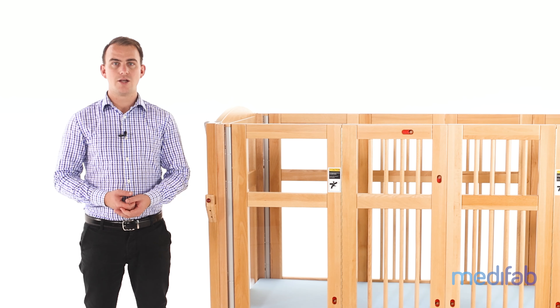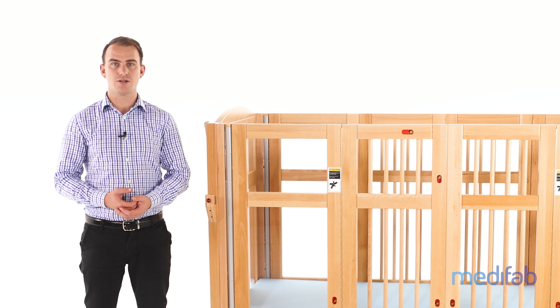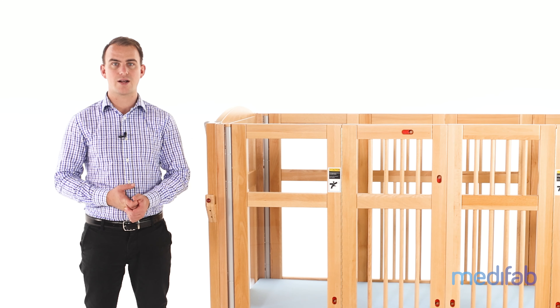In the event of a power cut, you will still be able to lower the bed to a safe sleeping height if it was left in the upper position. If you happen to live in remote areas or areas where power cuts are frequent, we would recommend running a UPS alongside the bed to ensure that it's never left in the upper position in the event of a power cut.